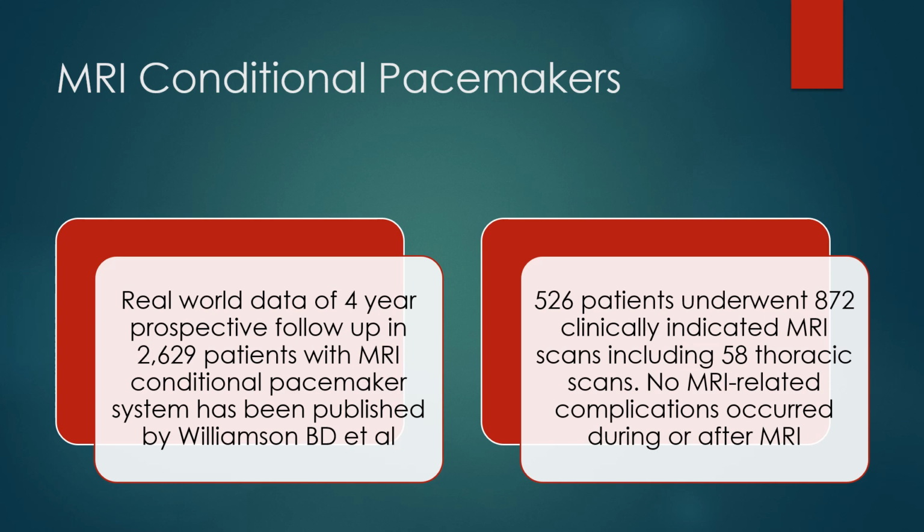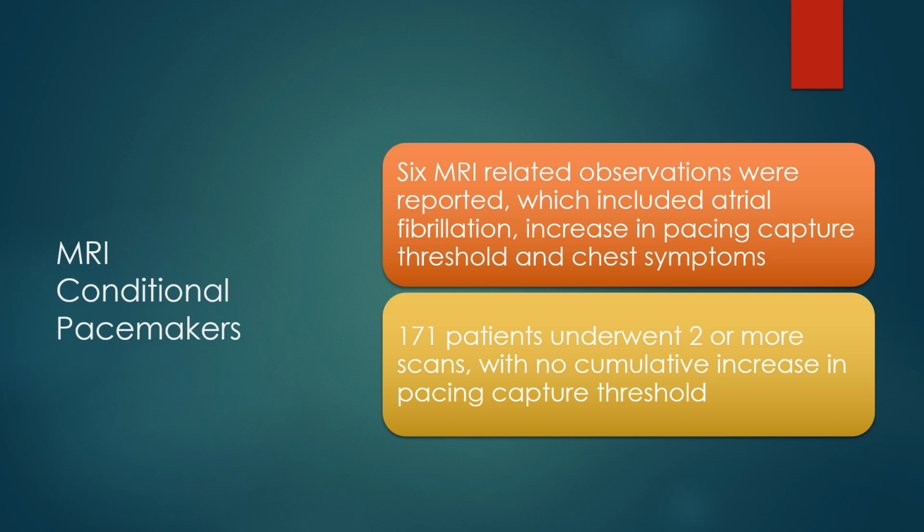No MRI-related complications occurred during or after MRI. 6 MRI-related observations were reported, which included atrial fibrillation, increase in pacing capture threshold, and chest symptoms. 171 patients underwent 2 or more scans with no cumulative increase in pacing capture threshold.